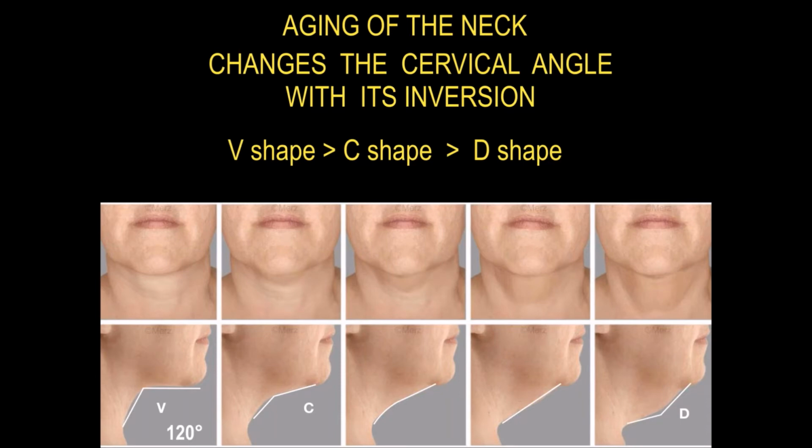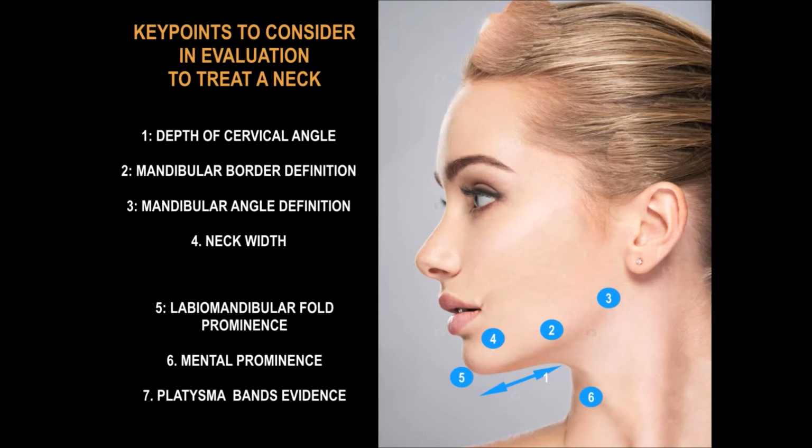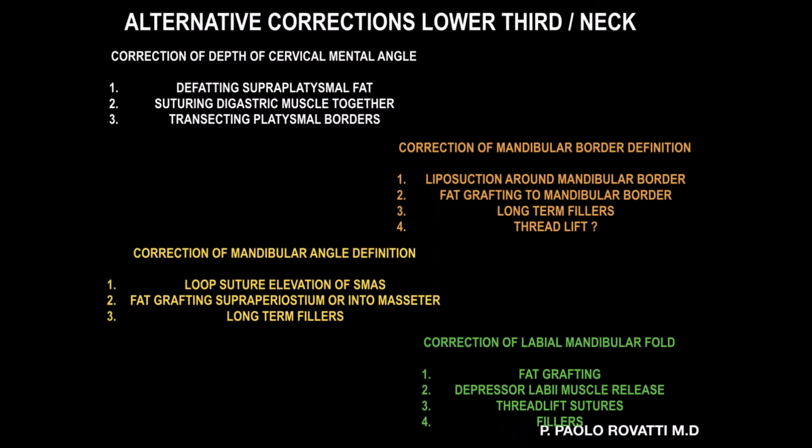So we need to consider some key points to evaluate how to treat the neck. First, the depth of cervical angle. Second, the mandibular border definition, that we can do with the AccuTite device. And mandibular angle definition of the border and the neck width. So there are some others: labiomandibular prominence, mental prominence, and platysmal band evidence that we can consider to treat, but this is the next point. So just a few things to tell you that we have an alternative correction about lower third and neck.